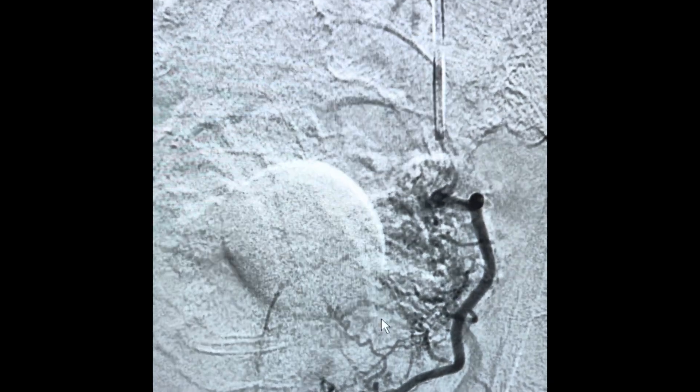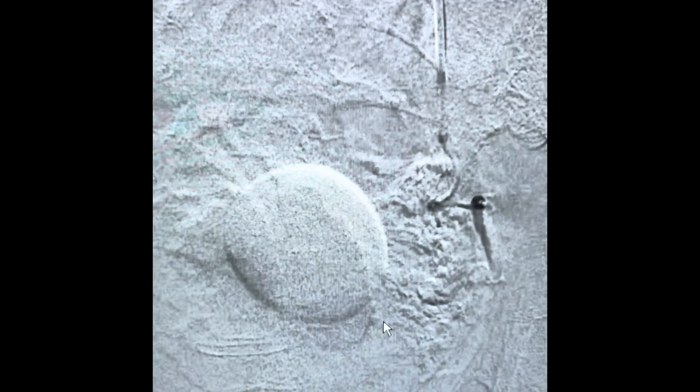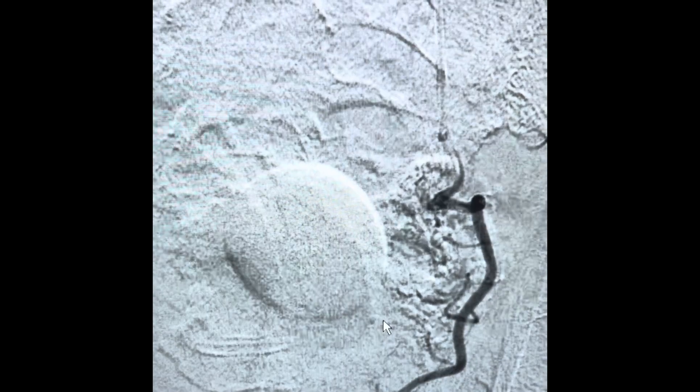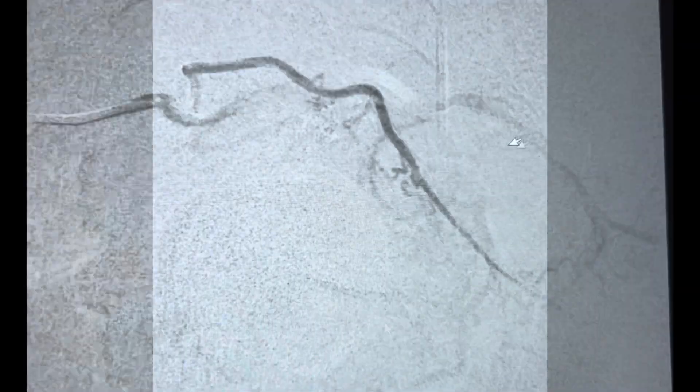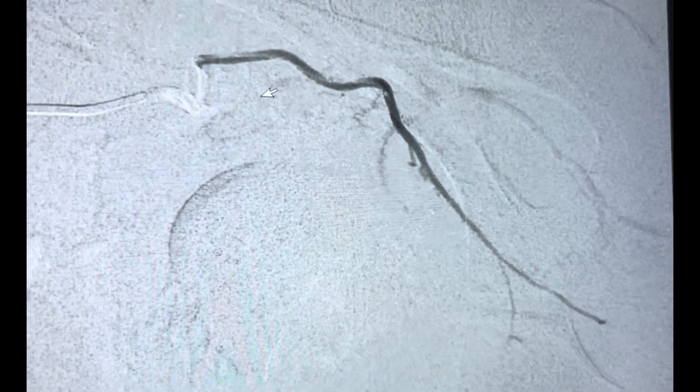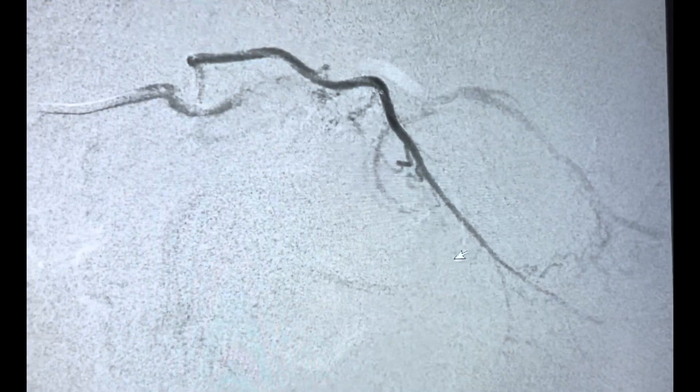We then start injecting the particles on this side again to stop the blood flow to the prostate. And as you can see, all of those enlarged vessels we saw going to the prostate gland are no longer apparent.